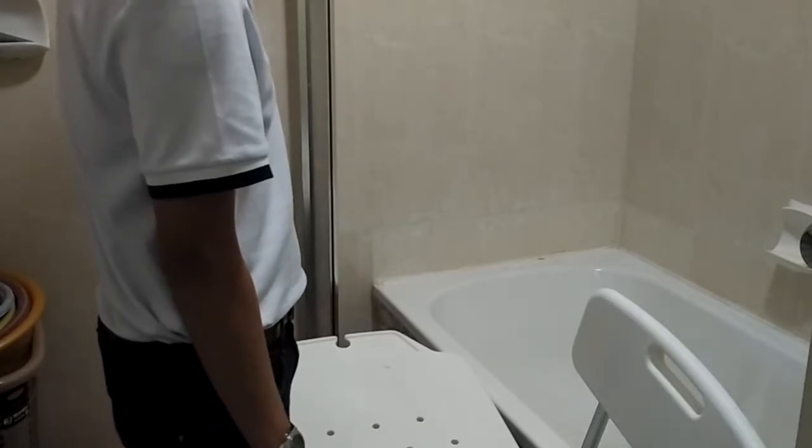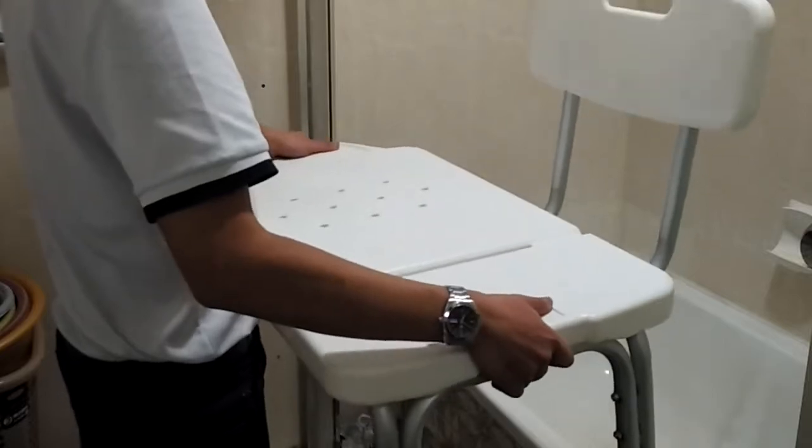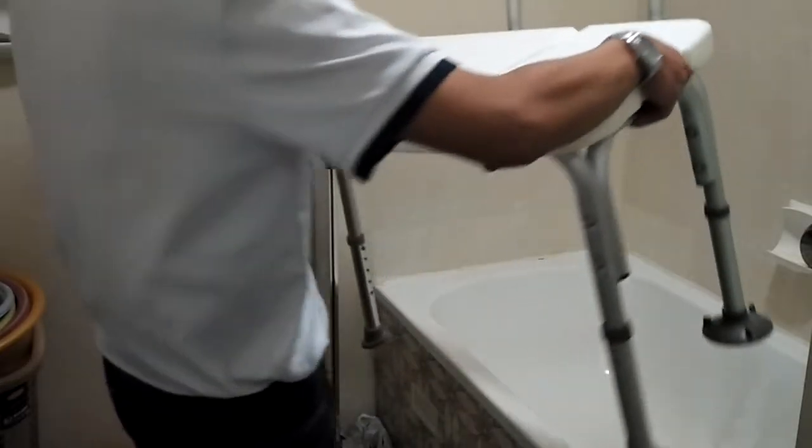Place the transfer bench transversely over the tub. Make sure to use safe manual handling technique by lifting with your legs and keeping your back straight to avoid injury.